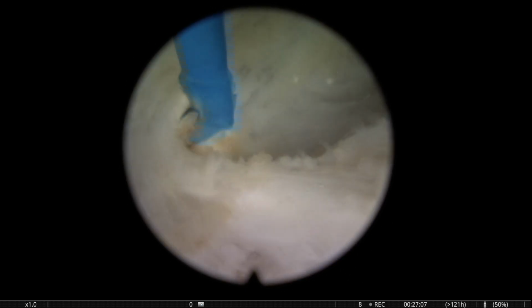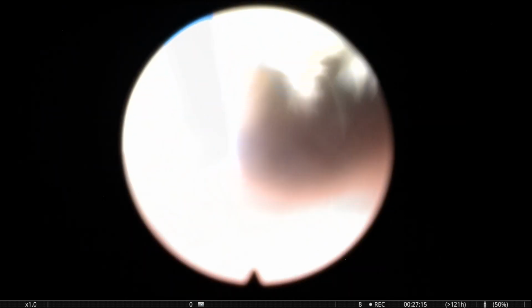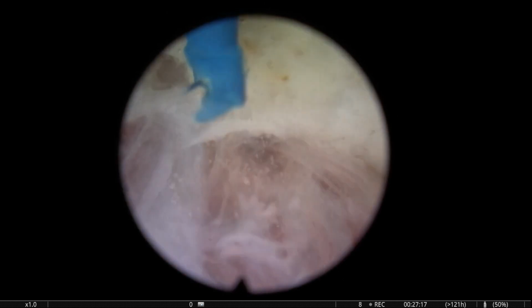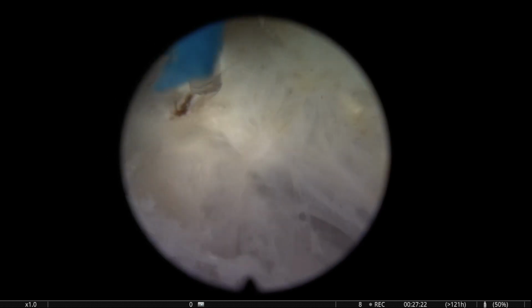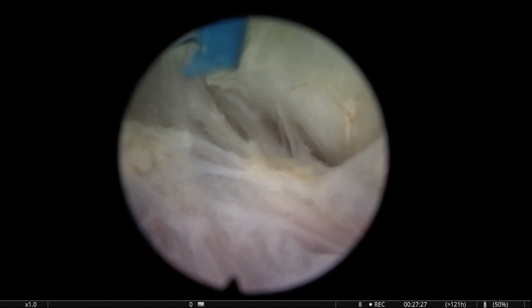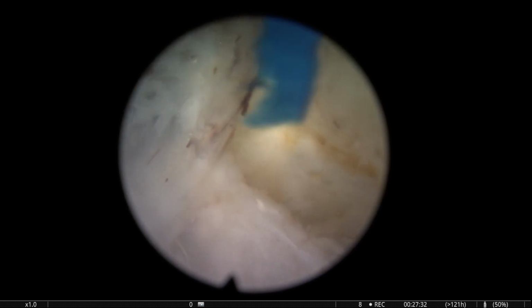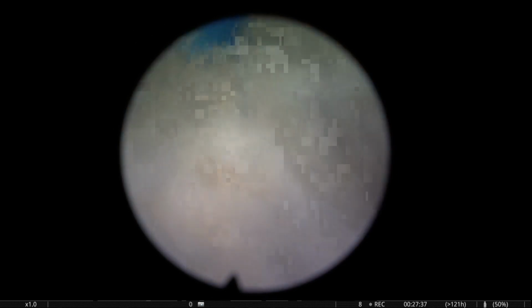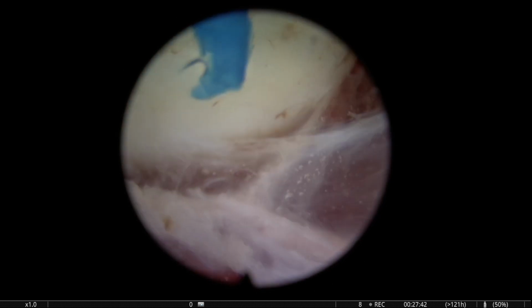And there we are. That is now the attachment at 6 o'clock. You see, sometimes these areas are quite sticky, and here again I keep the fiber close to the side of the adenoma to make sure that we can continue the dissection without deepening and trying to complete the procedure. You see, it's now 27 minutes into the operation. So, it takes what it takes. I'm not competing for speed.